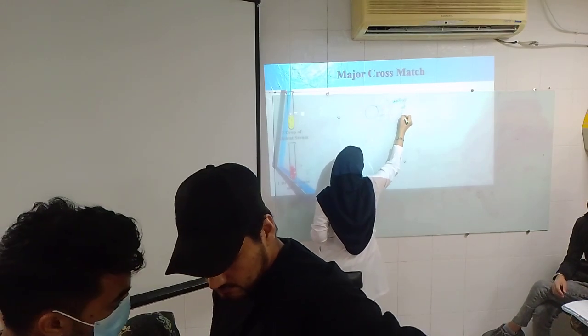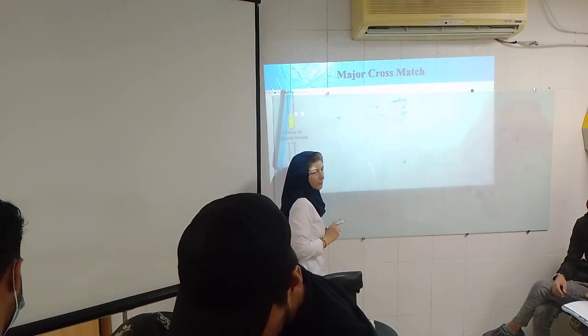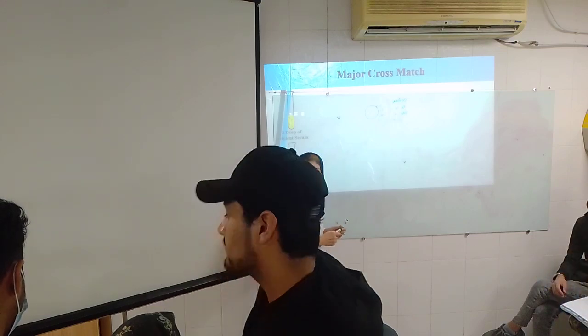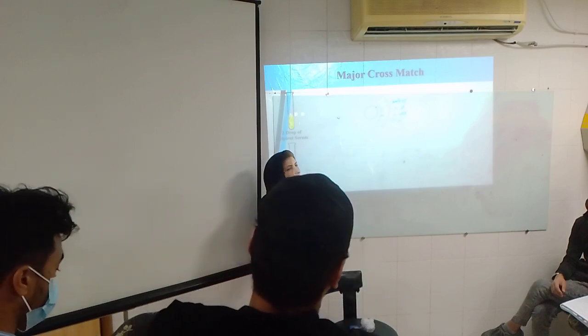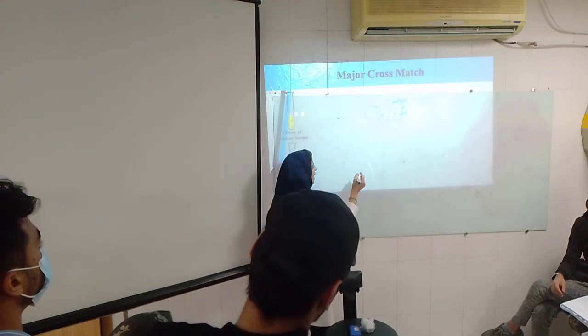As you see now. But we have some unexpected antibody again in ABO and RH system.